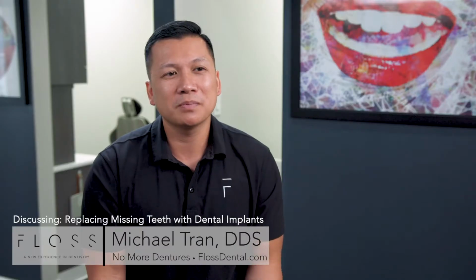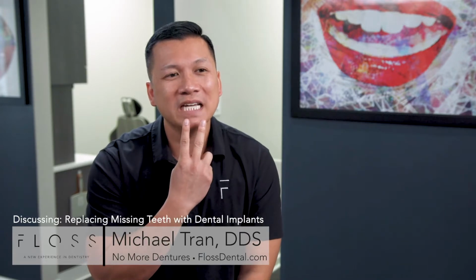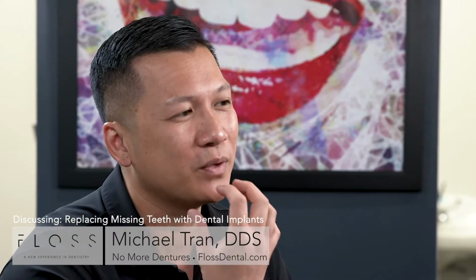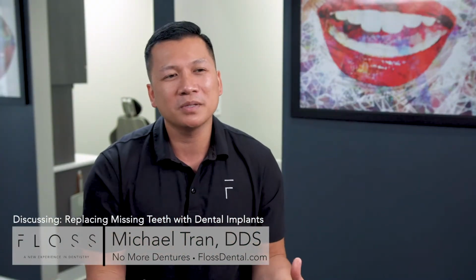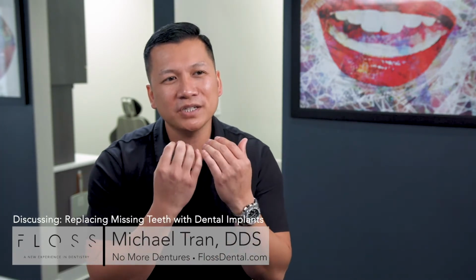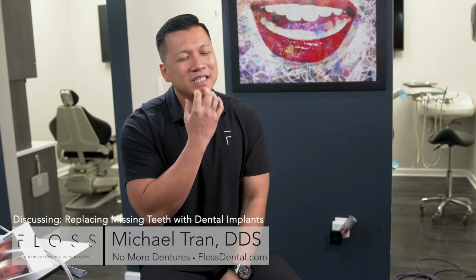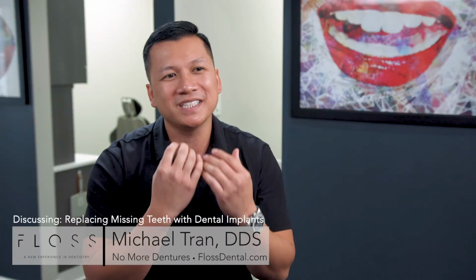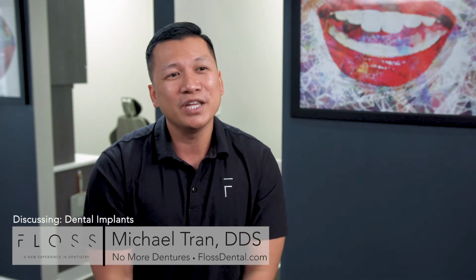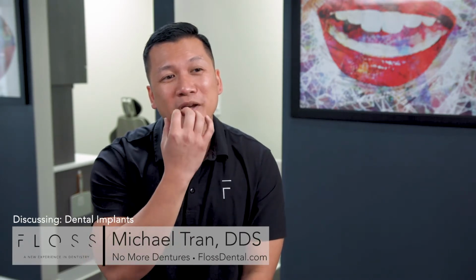So we have options for patients that can no longer save their teeth or they're currently wearing dentures. The first option is we'll place 2 implants here usually, and they'll secure their denture so it's not falling out. You're going to get a lot better result than a denture that's ill-fitting, that you can't really eat much. And a better option, well, we don't really do that option that much anymore because it's better than a denture that stays in your mouth, but it's not as good as a full set of fixed teeth. So a better option would be, we'll get 4 to 6 implants, and you'll get a fresh set of teeth that stay in your mouth permanently.